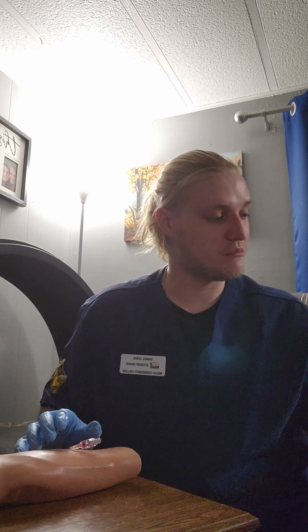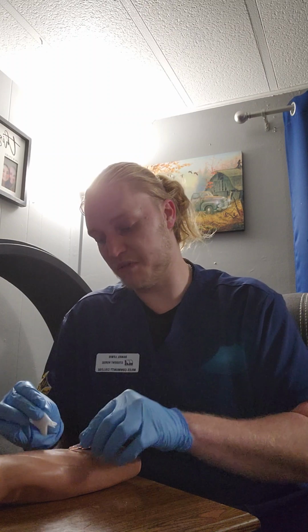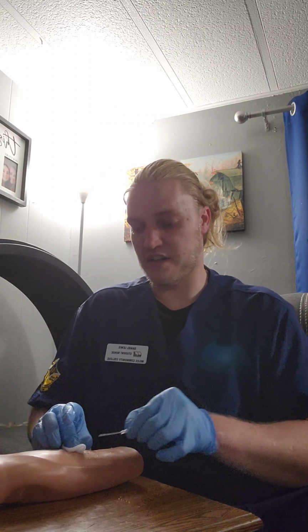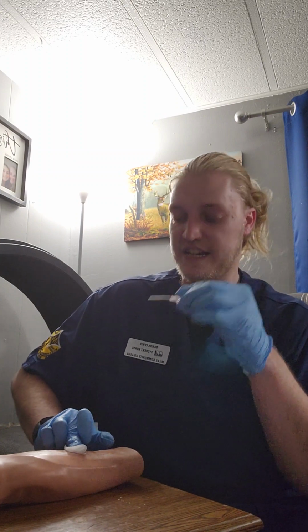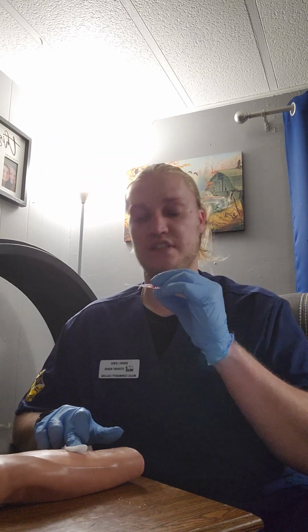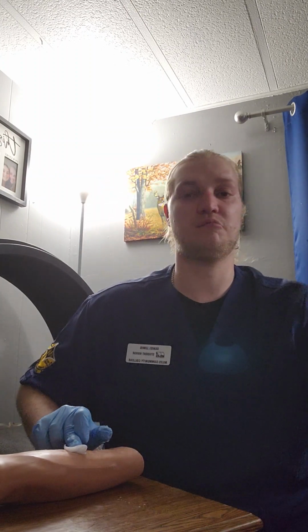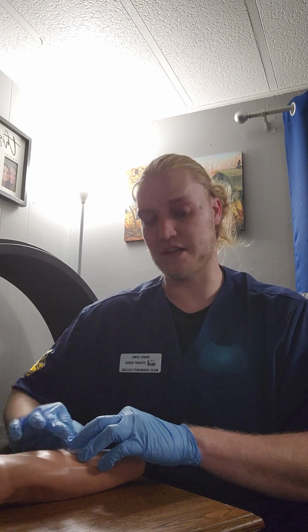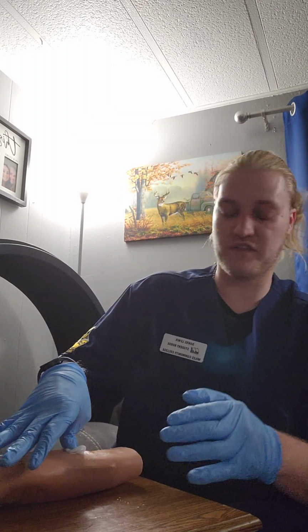And at this point, I'm going to have some gauze ready, and I'm going to pull out the catheter and check it for intactness. While I'm doing that, I'm going to apply pressure with this gauze. This catheter does look intact. I would put that in a sharps container because it would have the patient's blood, but I don't have a sharps container. So I'd apply this pressure for a couple minutes.